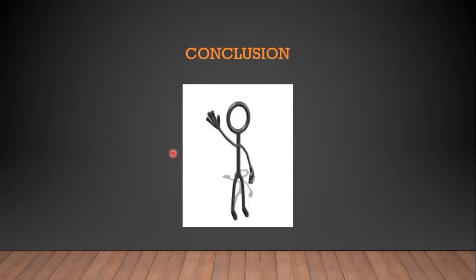So at the end, it matters how well a file performs while following a specific technique. That should not be the measure of effectiveness. Rather, how well the capabilities of the file can address the requirements of the anatomy should be the measure of its usefulness. And we can use different instruments for preparation and technique. The technique where you use more than one type of instrument is called a hybrid technique. Thank you.